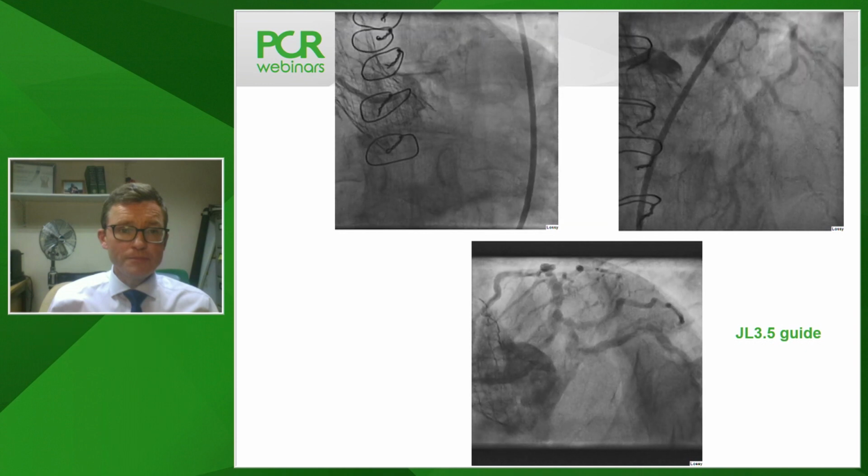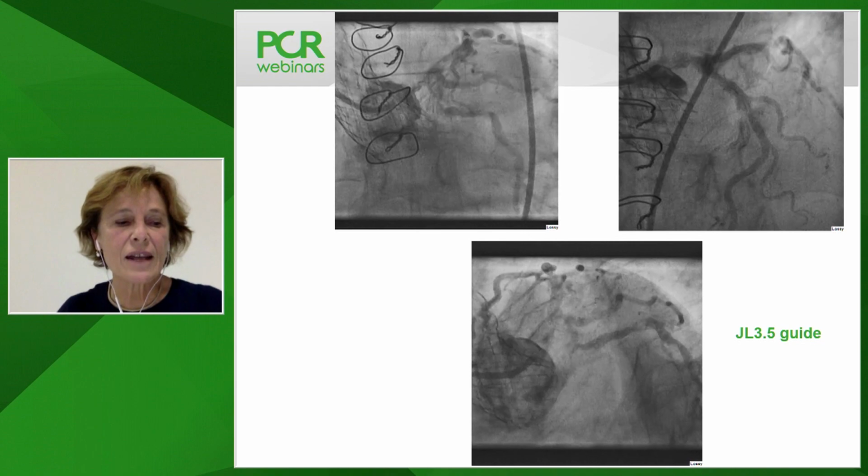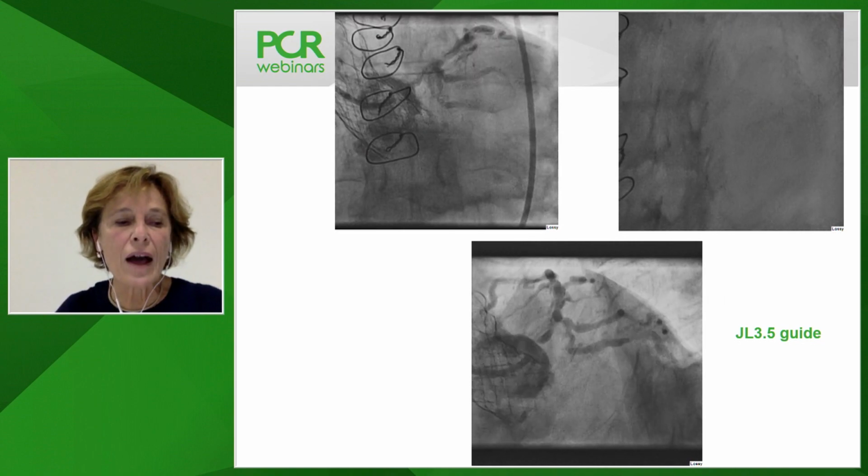We are receiving a few questions. Okay. One question is: can the new Portico valve, which has large cells, benefit in preventing coronary stenosis post-TAVI? I mean, are you able to engage it better?